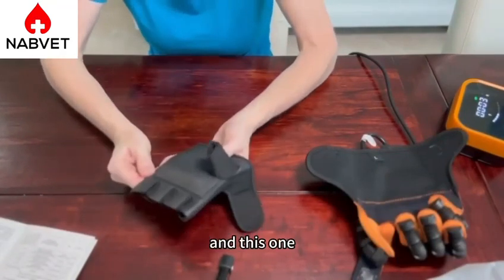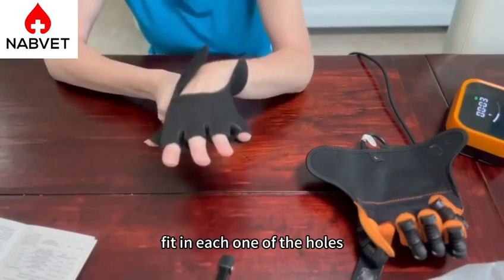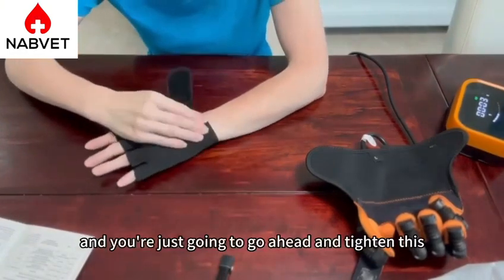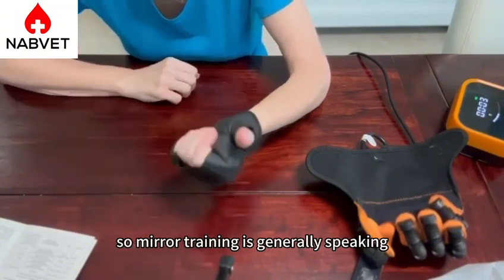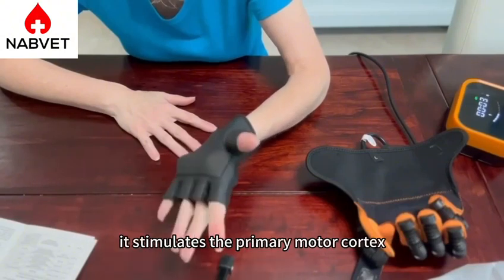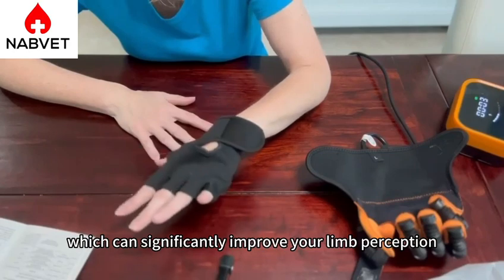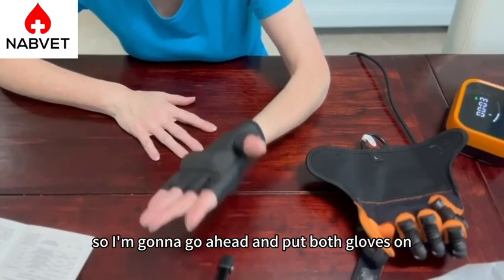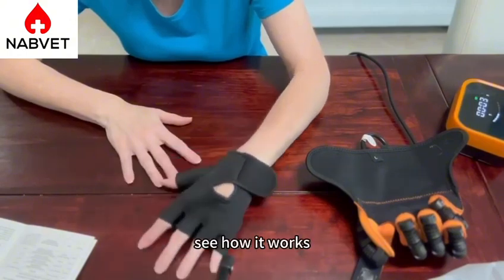This is called a mirror glove. Just insert it just like you would a regular glove, making sure that your fingers fit in each one of the holes, and then go ahead and tighten it on the other side. Mirror training, generally speaking, is the coordinated movement of the intact side and the affected hand. It stimulates the primary motor cortex, which can significantly improve your limb perception. I'm going to go ahead and put both gloves on, and we're going to put it inside the host and then see how it works.